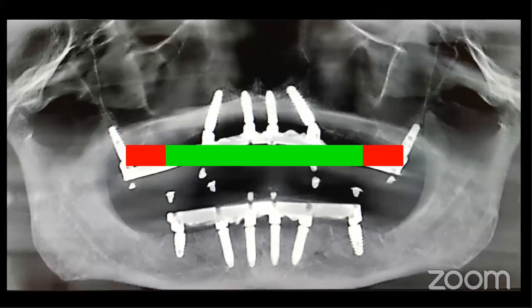Now, if you are limiting your restoration to a first molar, then when they smile that big, you are going to see a black space back in the buccal corridor, back in that area, because where their second molar should be, there's not going to be any second molars. You don't have any teeth back there with a standard restoration, and you're going to notice that.